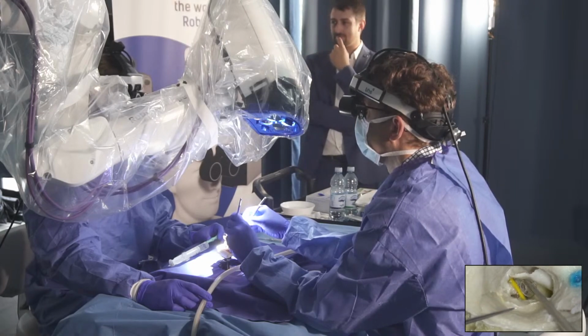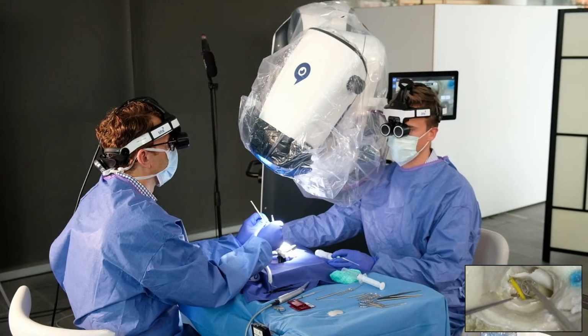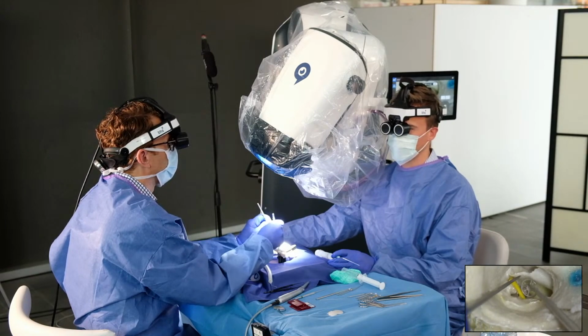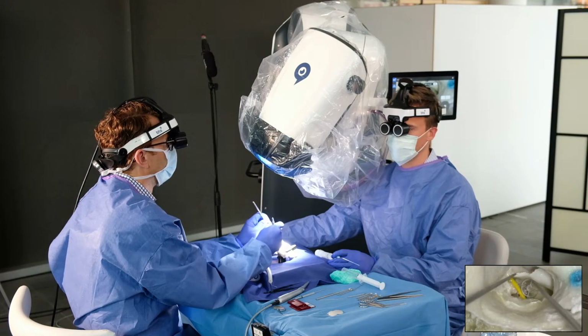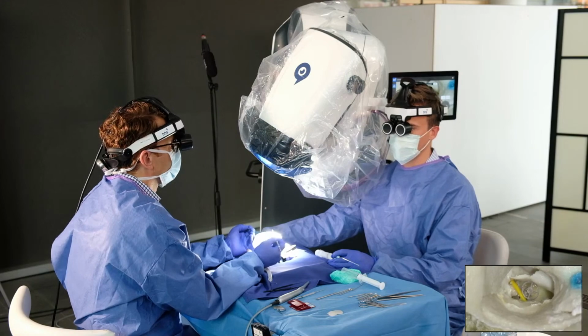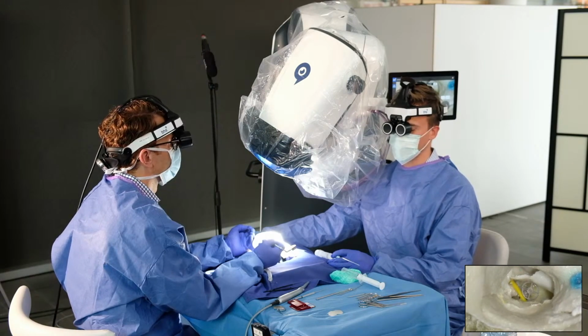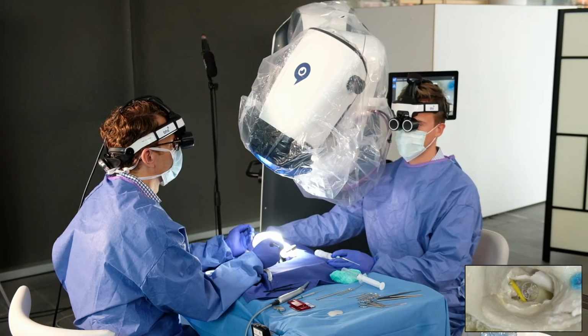Yeah, so here, this would be the end of the procedure, pushing the prosthesis a little bit down here, fixated on the stapes, and getting back the eardrum. Excellent. So it was an excellent procedure, two implants in one day, and we have also seen the cochlear implant with all the landmarks, the movability of the RoboticScope.